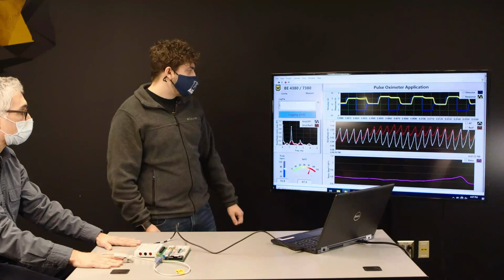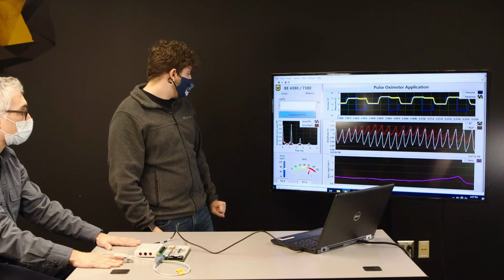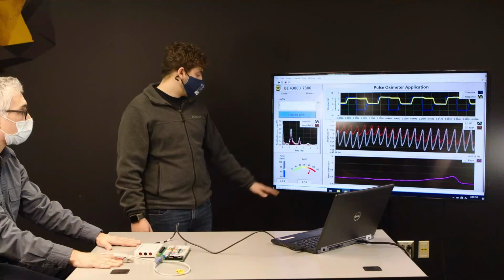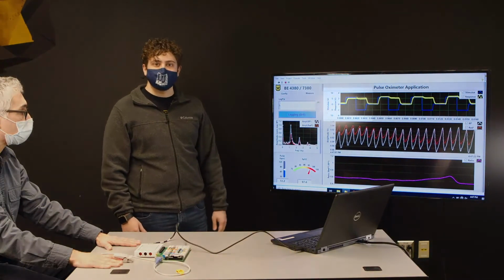And so now that he has stopped holding his breath, you can see it starts going back again to his normal average, which is around 97%. Yeah, thank you very much.